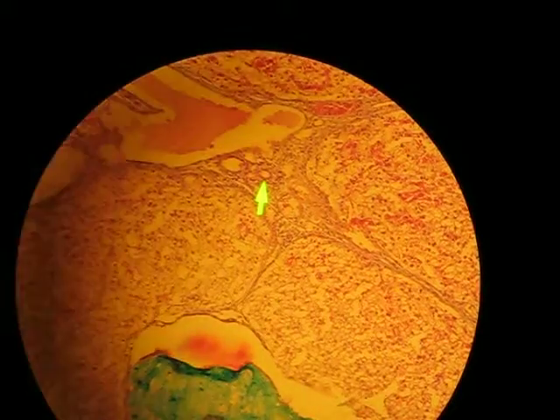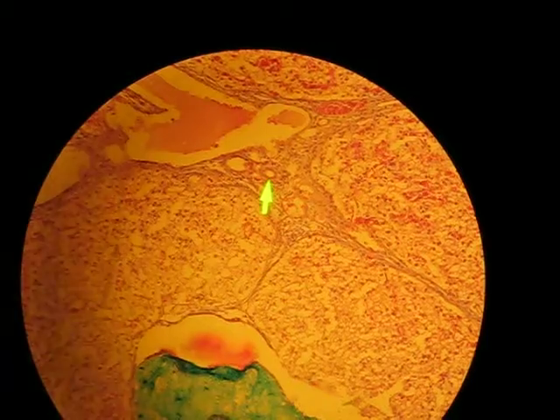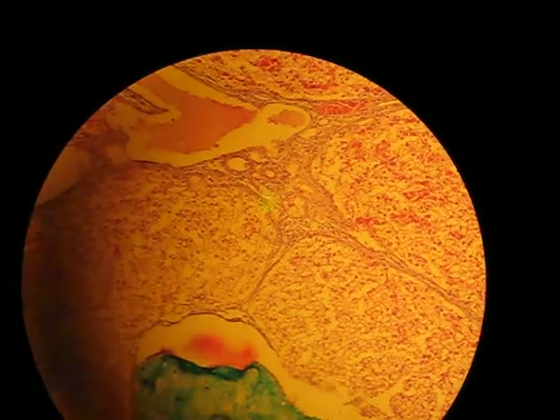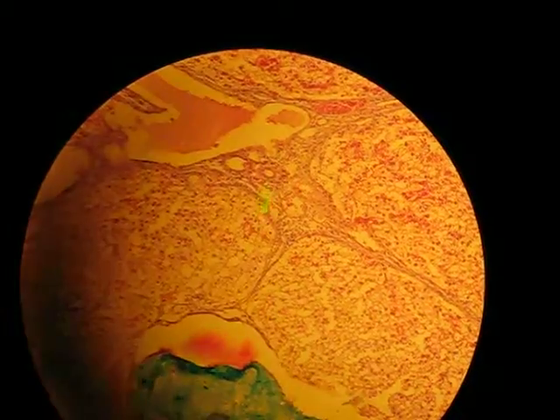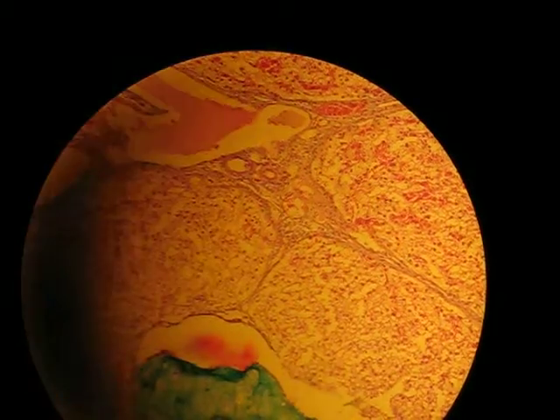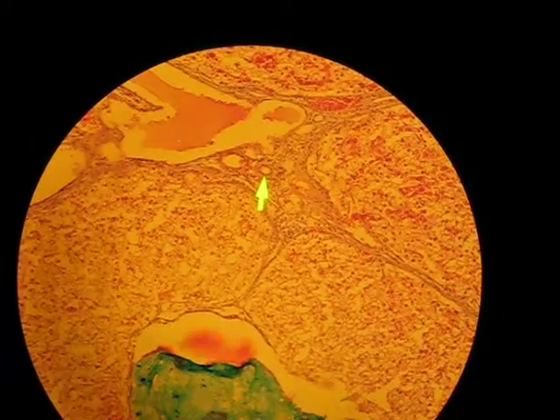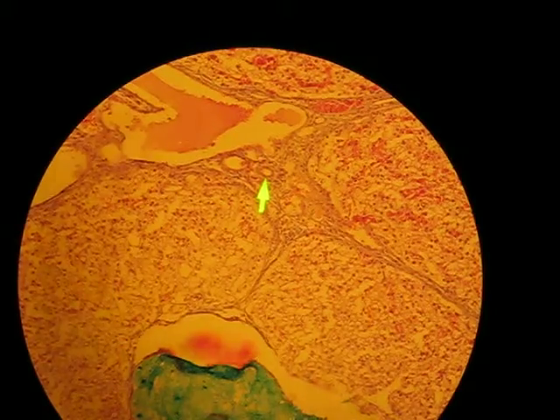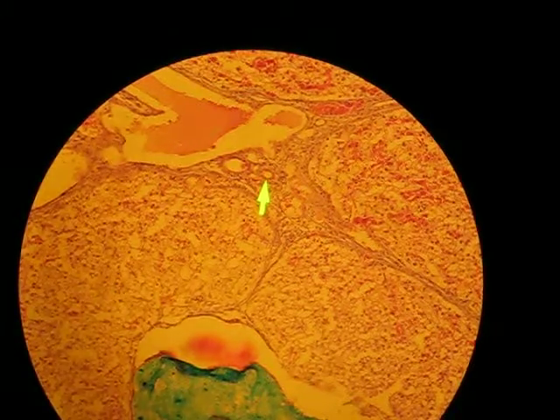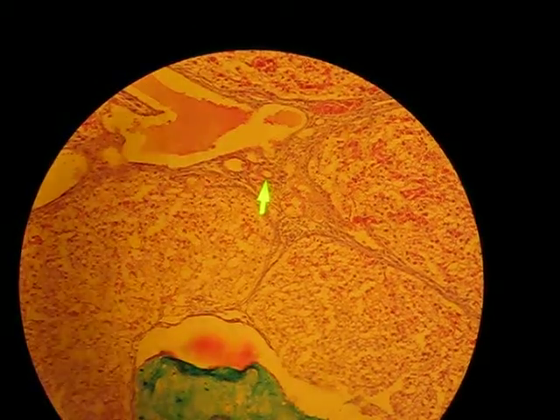So in addition to your hepatic artery branches and your portal vein branches and your bile ductules, there's going to be some nervous tissue probably, and lymphatics, yes, lymphatic ducts, and there's something else in there too. Connective tissue, obviously. Oh, and that was unmyelinated nerves, but you're not going to notice. Okay. So, unmyelinated nerves. I forgot that.